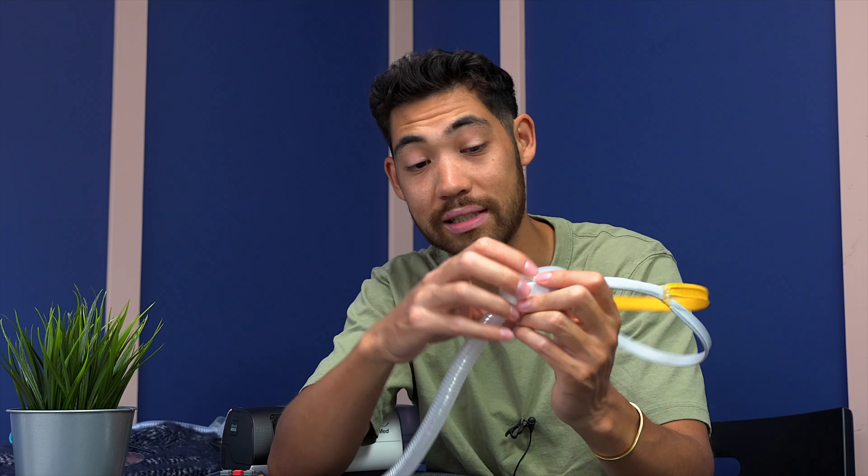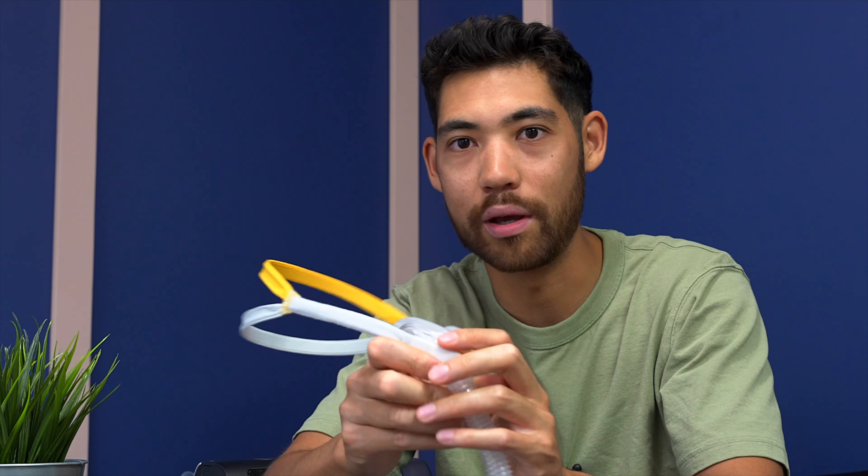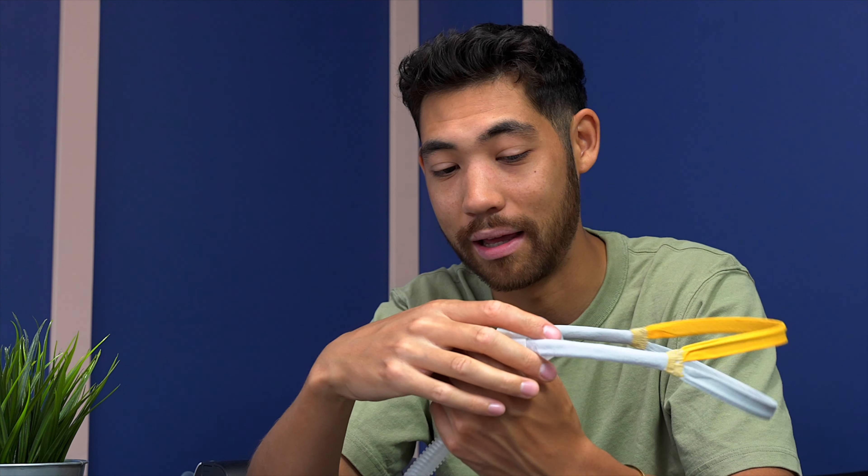That said, the diffuser holes on the P10 are a lot finer. So if you have COPD or hate the feeling of exhaling against resistance, the P10 might not be for you because it's definitely a little harder to exhale. I do recommend turning on EPR settings — expiratory pressure relief — which helps. If you're at 15 cmH₂O or higher with a P10, it gets a little tricky to exhale, especially if the diffuser gets dirty. Below 15 with one or two levels of EPR, it's pretty comfortable. The Solo is actually a lot easier to exhale out of at higher pressures. But if you have a spouse and they don't like wind blowing in their face, you might end up sleeping solo because of the diffuser.